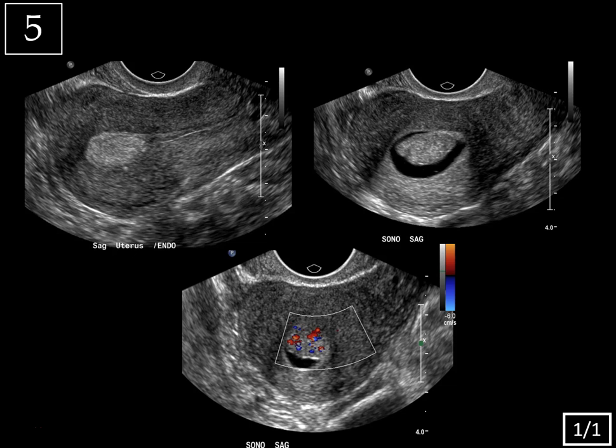Last case, slide one of one — uterus. On this left upper image, you can see that there's an ovoid echogenic mass-like focus that seems to be expanding the fundal endometrium. Here's a more normal appearing portion of the endometrium at the uterine body with a tri-laminar, somewhat late follicular phase appearance.